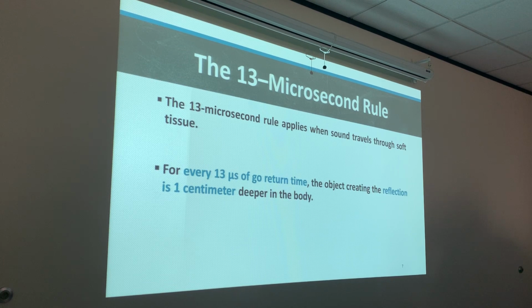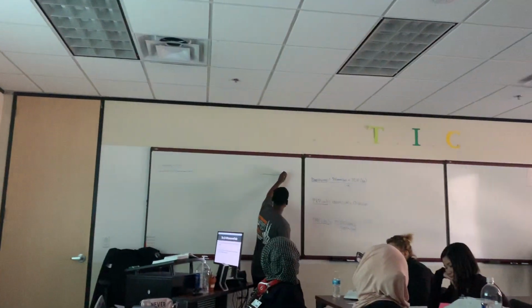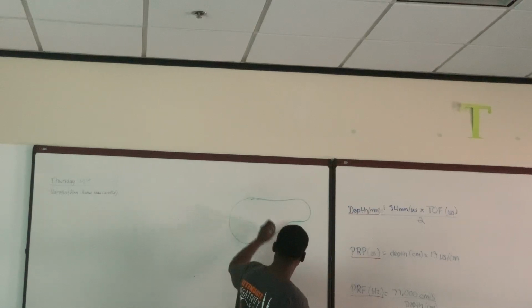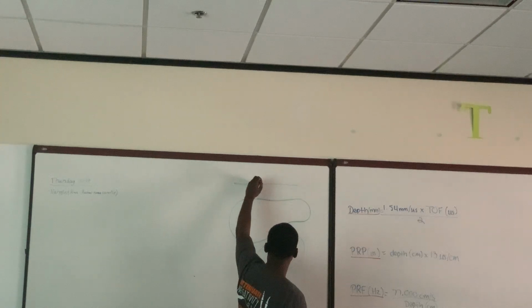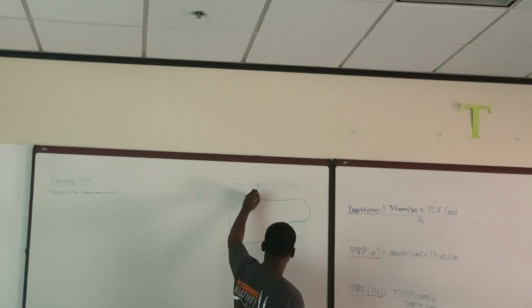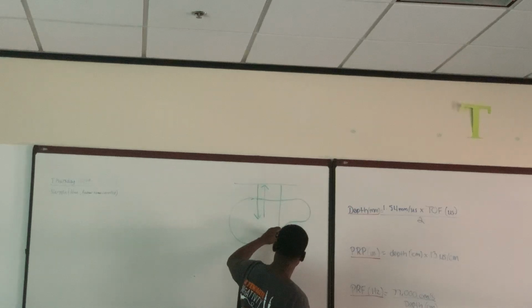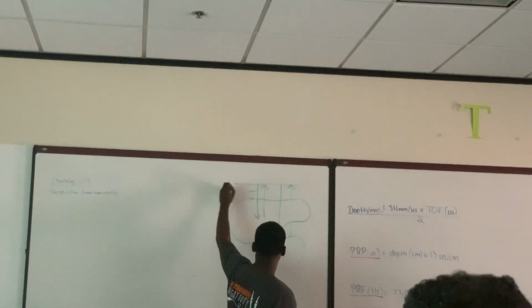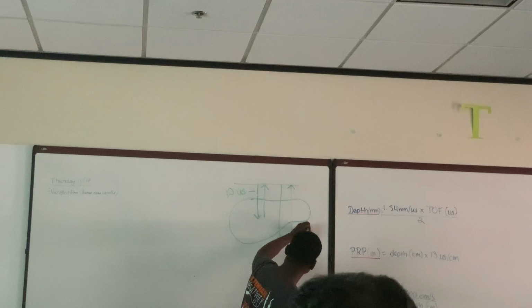And these are just relative numbers I'm going to use. Remember, relative is not absolute, guys. So don't hit me with no accuracy numbers. Okay, so let's set our transducer right here, and boom, let's just say to get to this point right here, I'm gonna exaggerate, get right here and come back. That's 13 microseconds. Bounce off right there, and to get to this reflector and come back, that's double that time. So this is gonna be 13 microseconds, and this is going to be 26 microseconds.